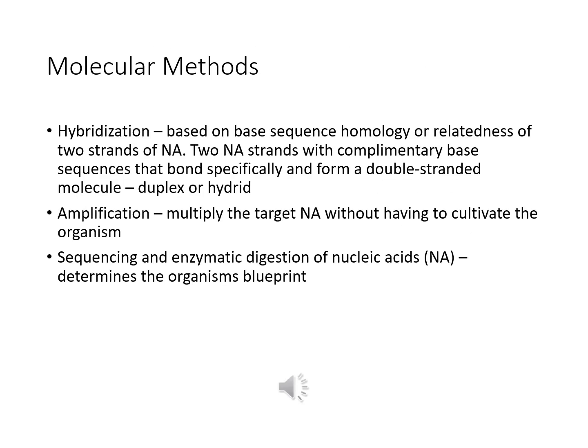So, molecular methods. With the launch of molecular methods, there's actually a variety of different techniques. We have hybridization, amplification, and sequencing. Hybridization is based on a base sequence homology or relatedness of two strands of nucleic acid. So nucleic acid strands with complementary base sequence bond specifically and form a double-stranded molecule, which is a duplex or a hybrid.